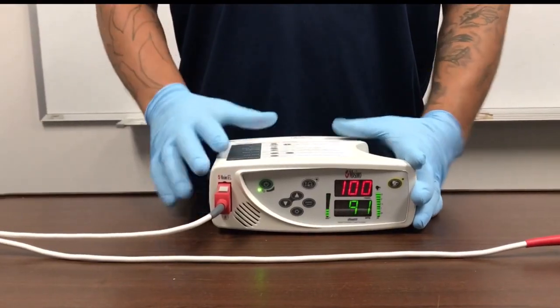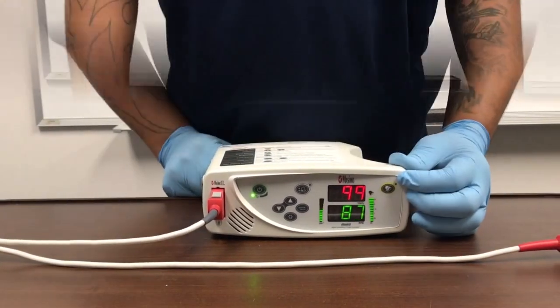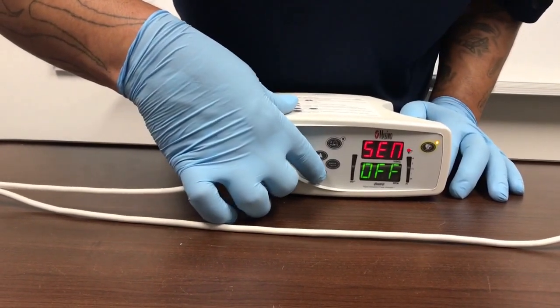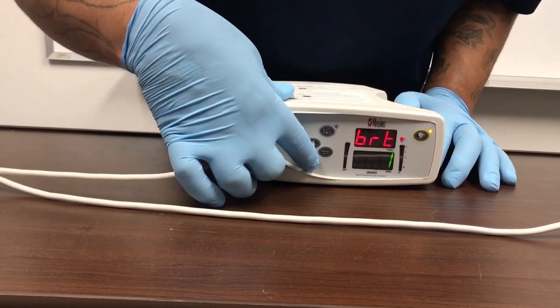Your RAD8 does have a battery that will last up to 4 hours when not plugged into the wall. There is also a brightness setting — hold down the brightness button and that will allow you to adjust.